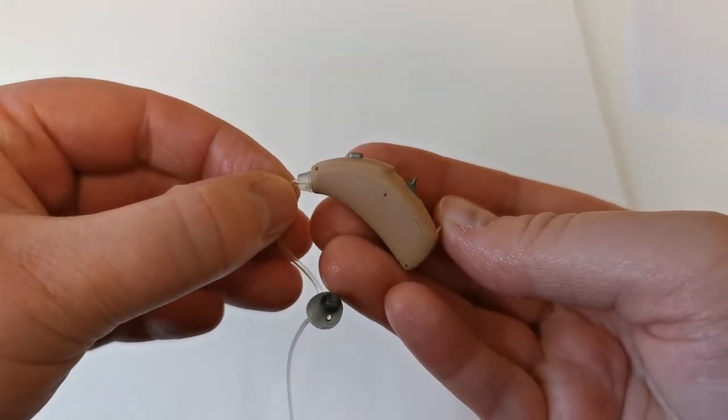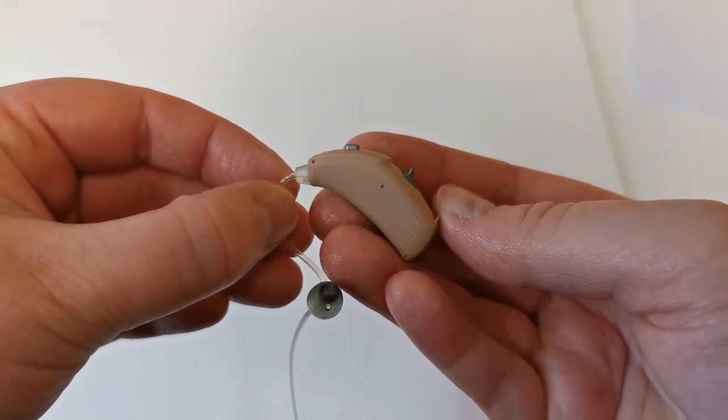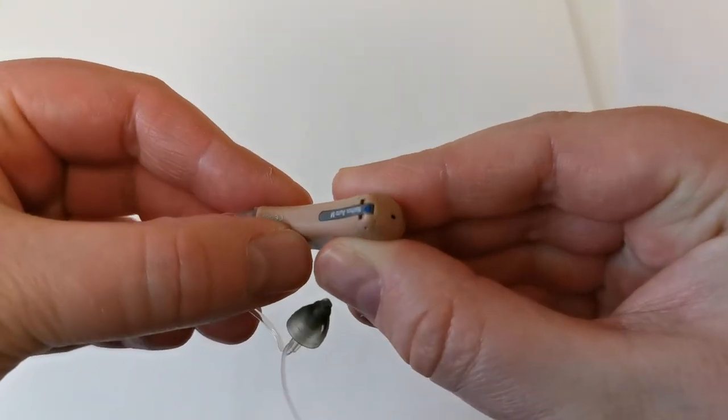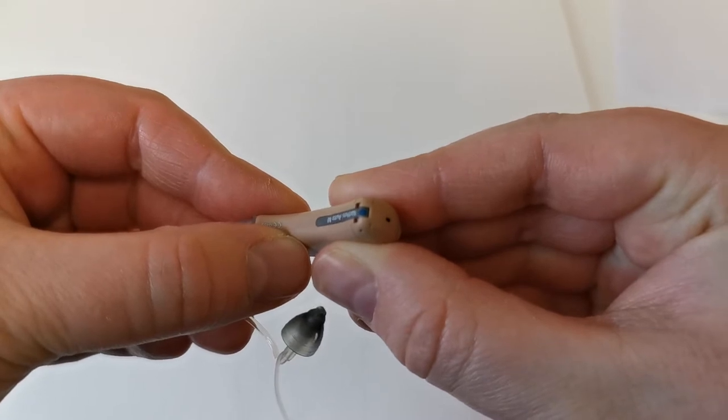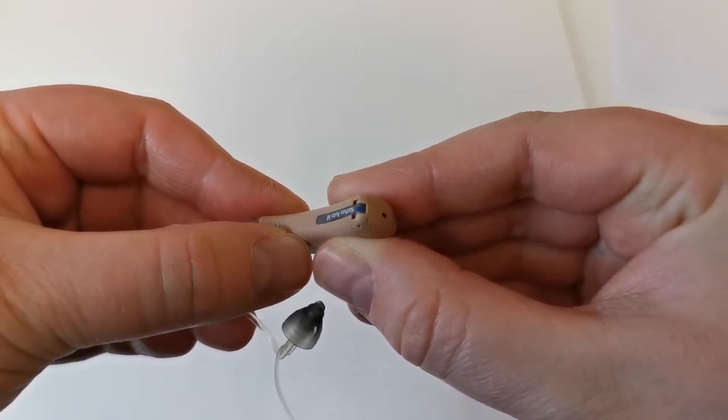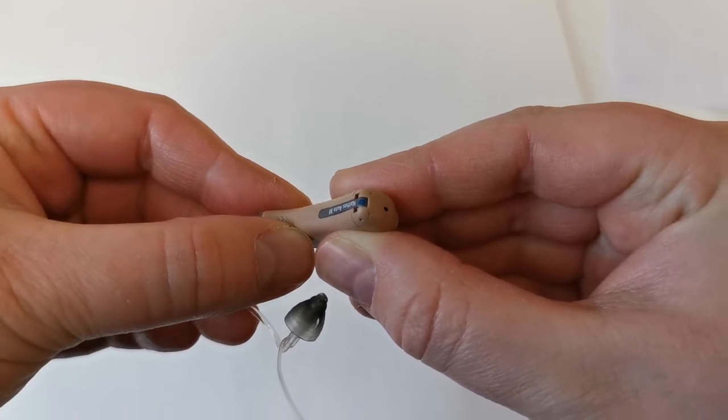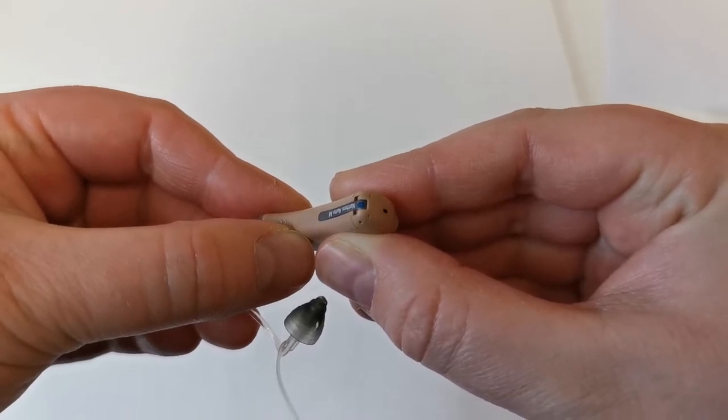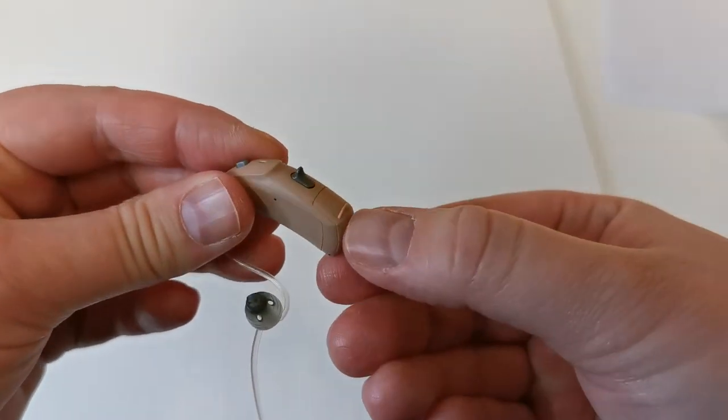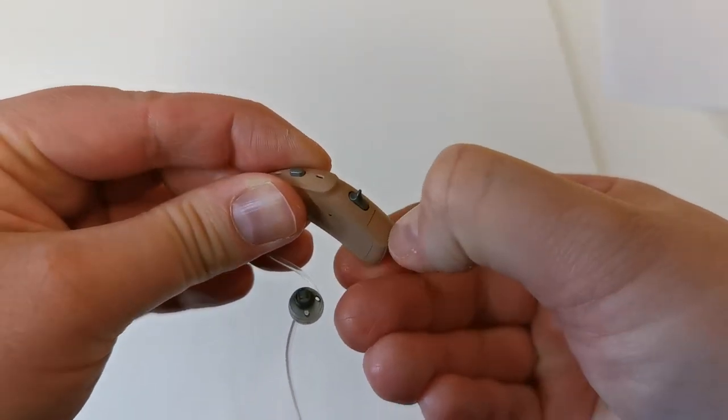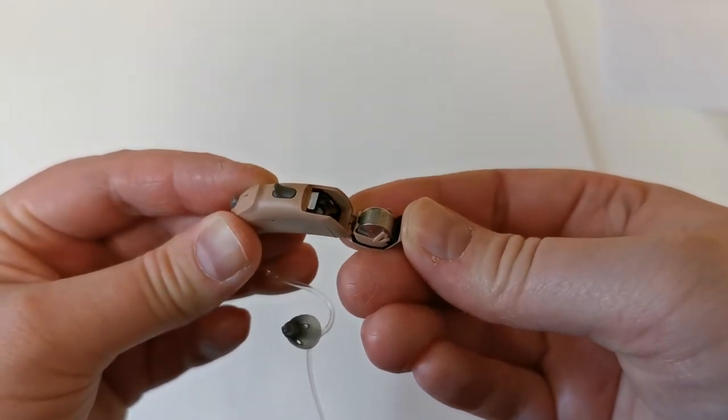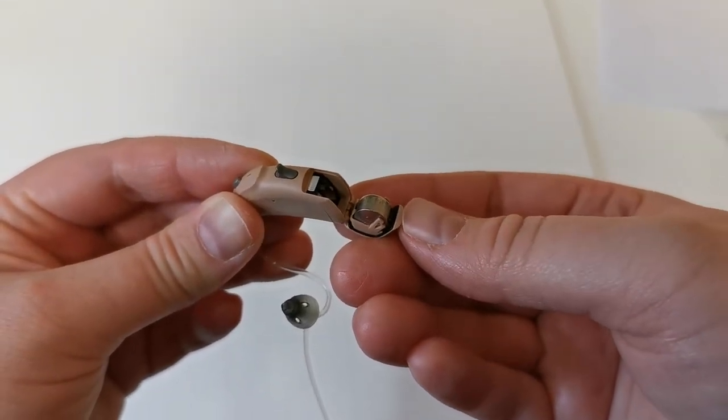In this video we will show you around the hearing aid. At the bottom of the hearing aid there is a left or right marker. The left-sided hearing aid has a blue marker and the right-sided hearing aid has a red marker. The lip at the bottom of the hearing aid is for opening the battery drawer.